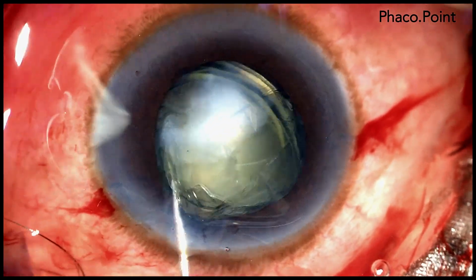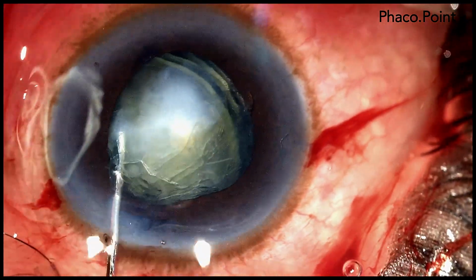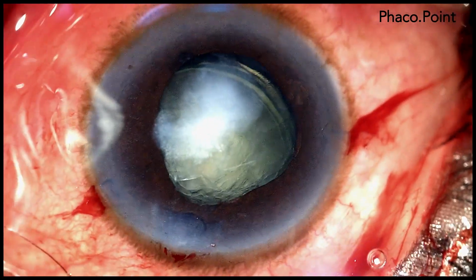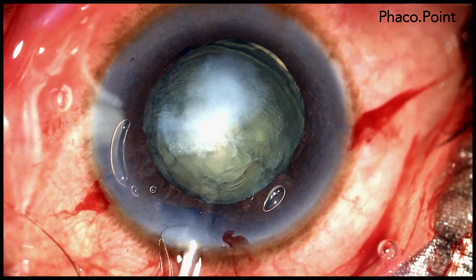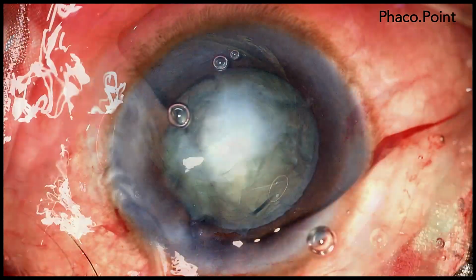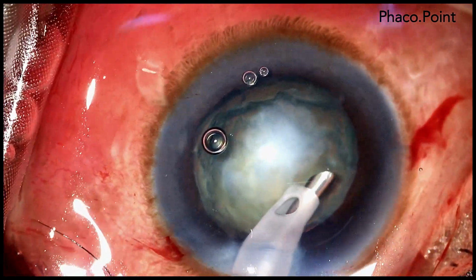When I complete the hydrodissection on the left side, you will notice that there's a prolapse of the inferior pole of the nucleus into the anterior chamber. I introduce some more viscoelastic, a dispersive viscoelastic this time, after which we are ready to perform the nucleus management. The Phaco probe is introduced into the eye.